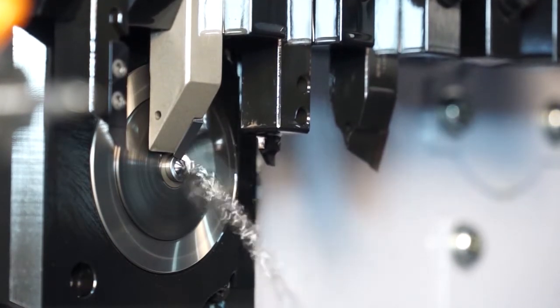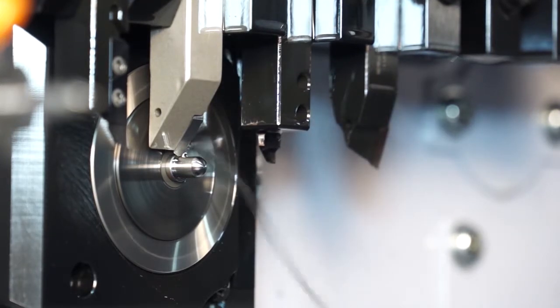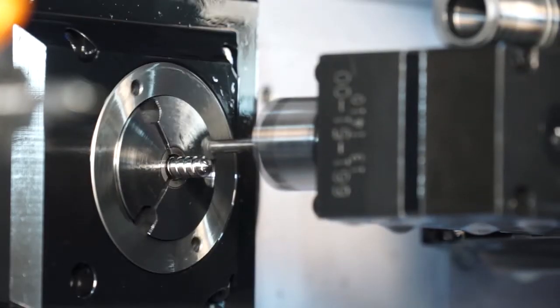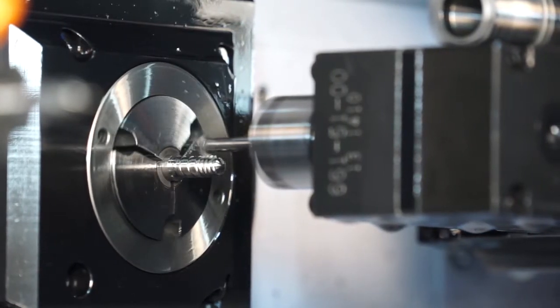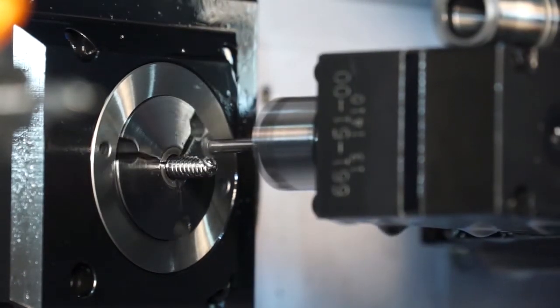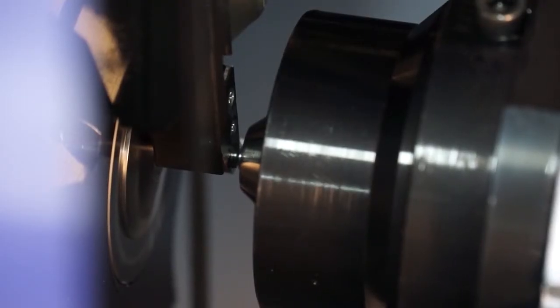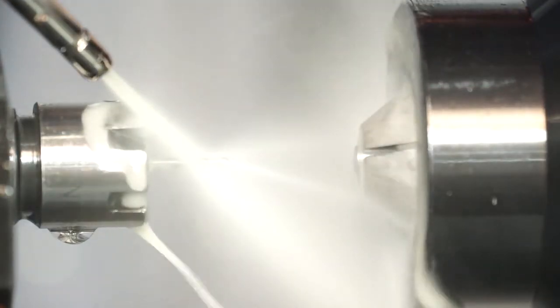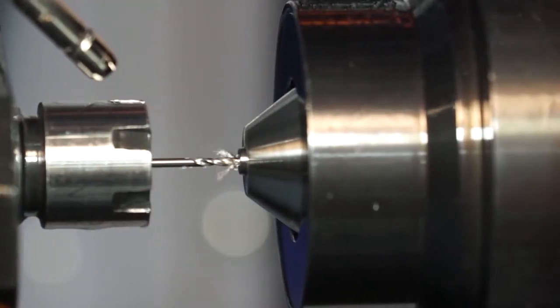At first, external milling proceeds with a special cutter which has an individual contour. When the external thread is ready, the part is cut off the main rod and transferred to another machine, where the platform hole is cut out. After that, another instrument cuts out the platform and slices the thread.